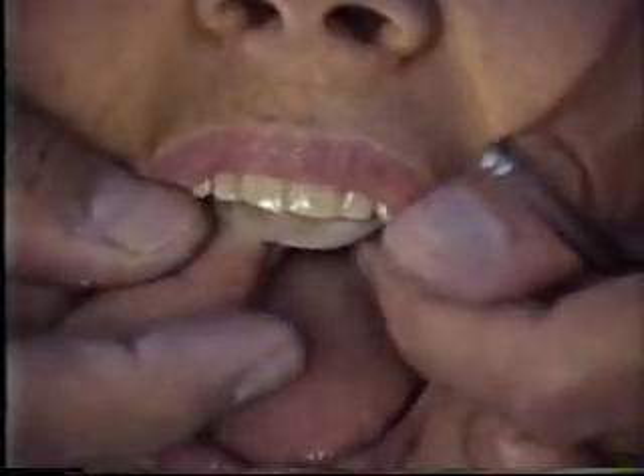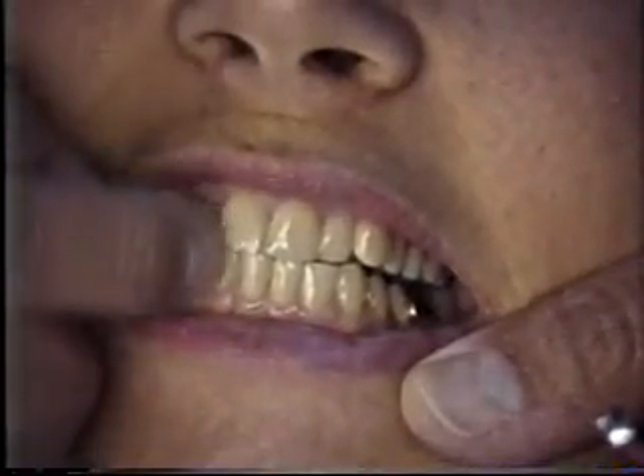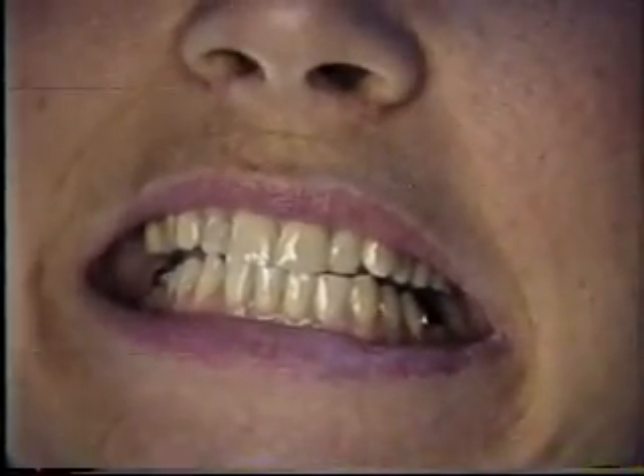But when we put the splint in, it brings the jaw forward, lines up the freni or the midlines, and it also allows for the laterals moving. She wants to do it, but she doesn't wear this when she eats.